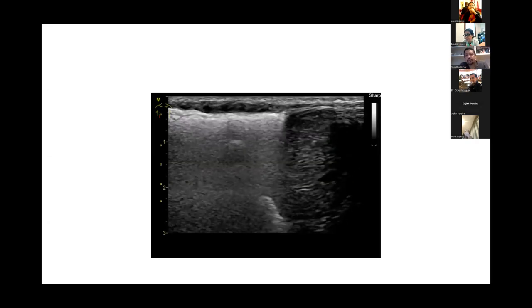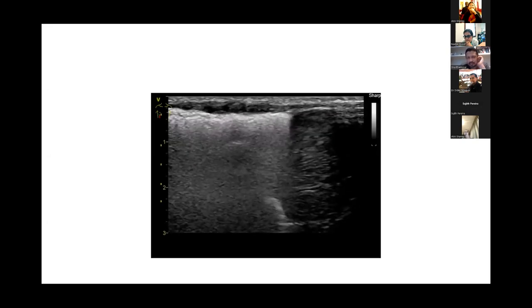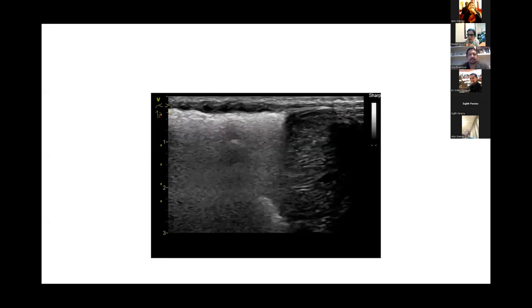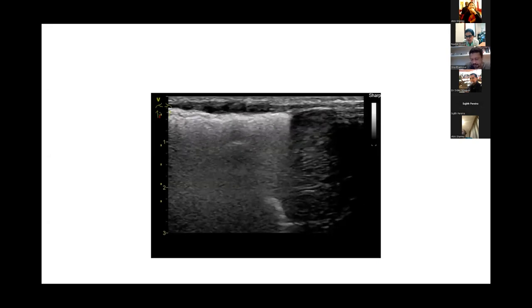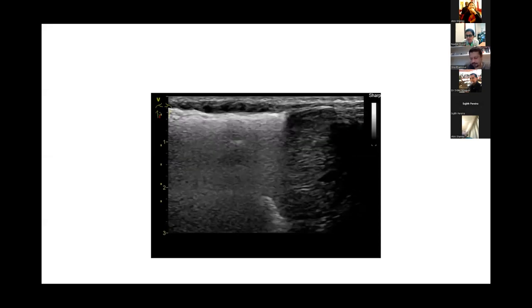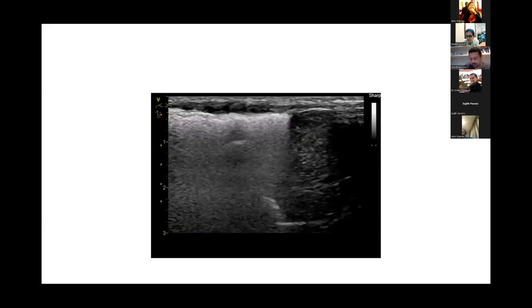Okay. In adults, so you mean that deep consolidation should be associated mostly with a break, like discontinuation of the pleura? It must be for us to see it. Yeah. So if we're seeing something and there is no break, it's not a consolidation. It's just, okay, you know, we're using the limitations of the technique. In adults, maybe less than 10%, maybe 10% of, for example, pneumonias are not in contact with the pleural line.